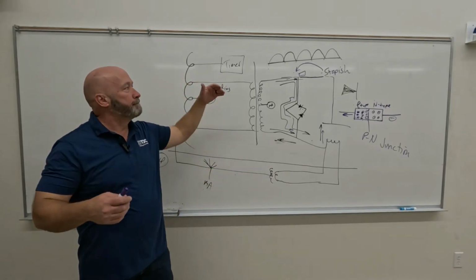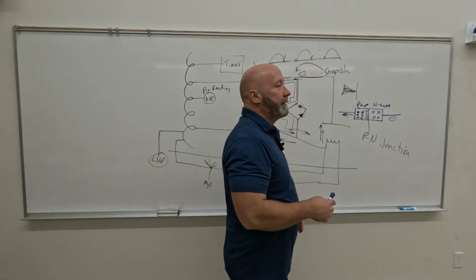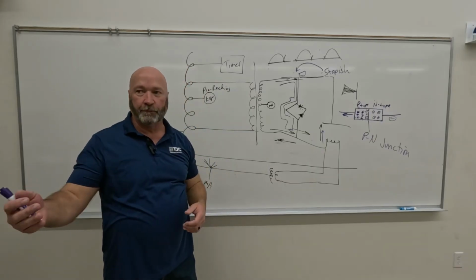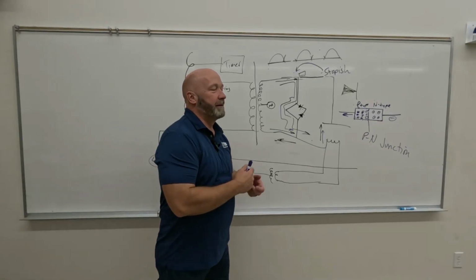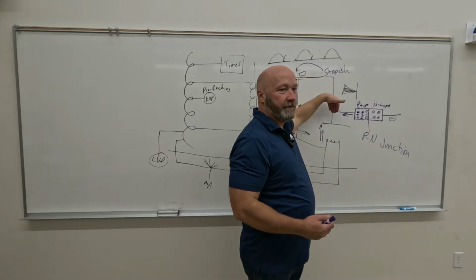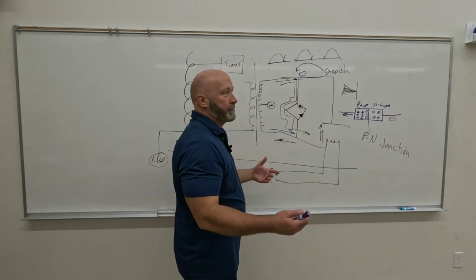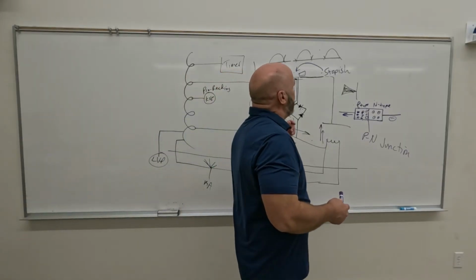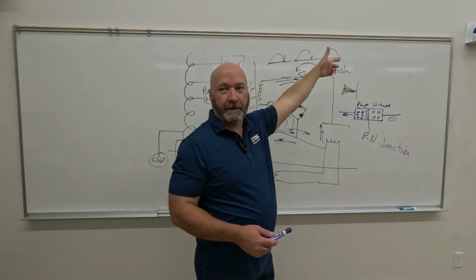So if we're only using half of the wave, let's say we've got a dental unit, that's what we refer to as a self-rectifying unit. The X-ray tube becomes a rectifier. It doesn't really become the rectifier. It's just that the electrons have no chance of jumping from anode to cathode. Okay. So in that way, it becomes a rectifier, but they call it a self-rectifying unit. So how much of the wave are we using there? Half. So we're going to call that half wave rectified.